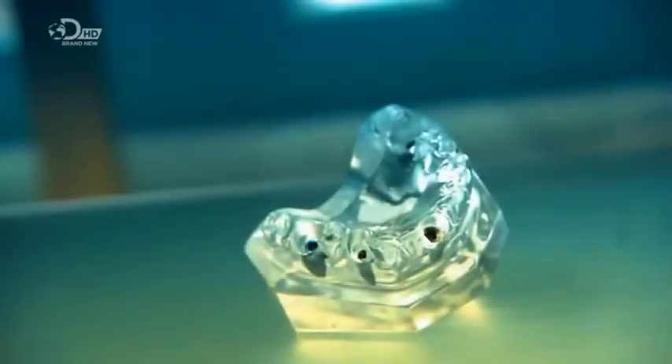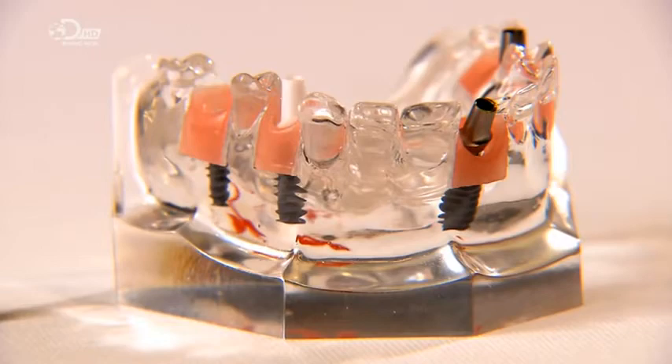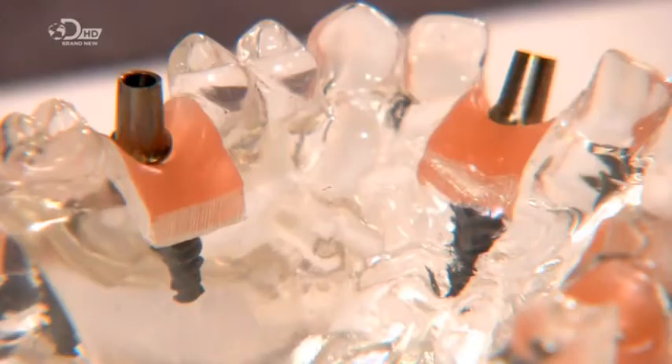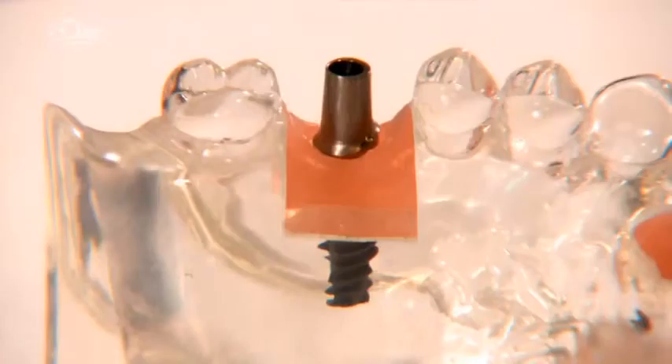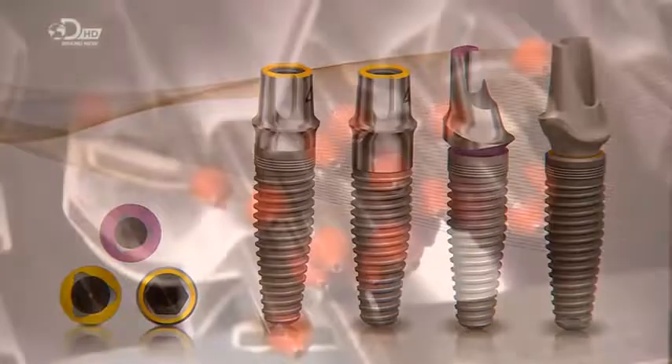And of course, they're screwed in, not hammered. In the middle of the 20th century, it was discovered that titanium is a metal that bonds with bone. It revolutionized restorative dentistry, making enduring tooth implants possible.